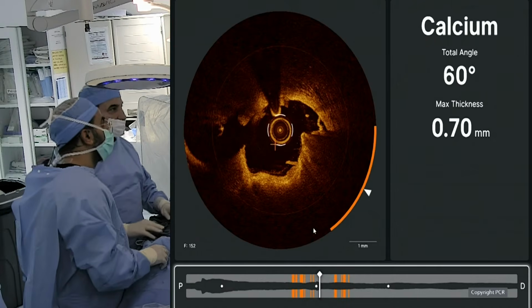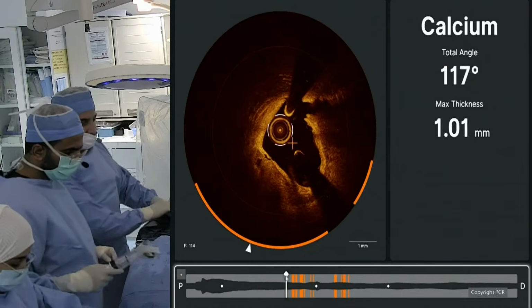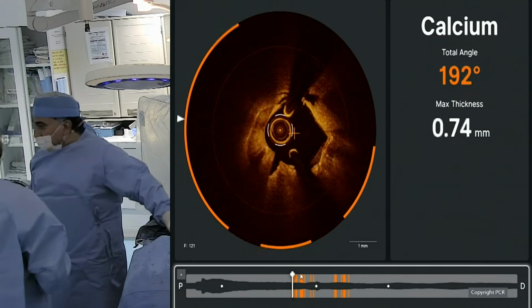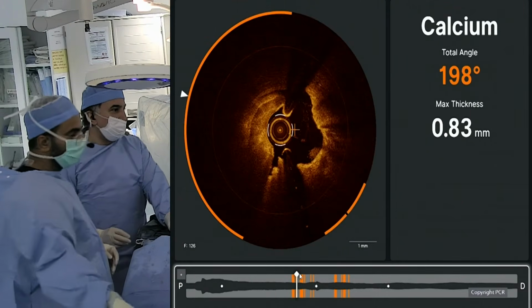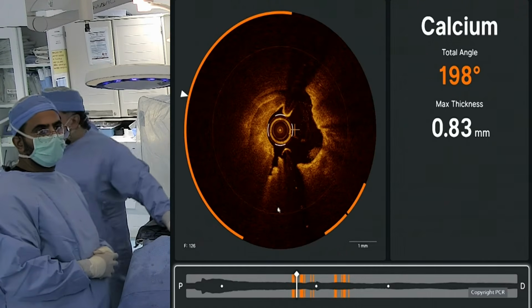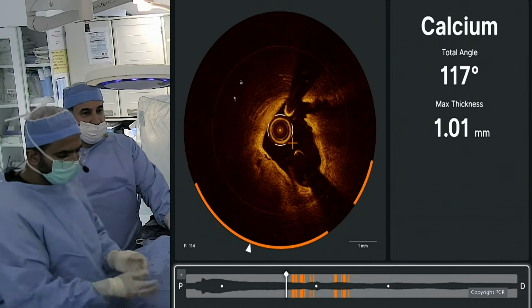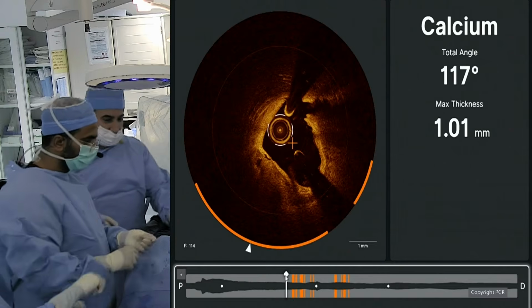And if you can go proximally. Give me a 2x30 balloon, regular. You can see a lot of damage at all. And this is some plaque that we have before in the proximal part. Here you can see that the calcium is almost encircling the vessel. But it's cracked. Before the yellow, before the orange, there is still some significant plaque. We needed to understand where to land. Can you see that there is still clearly calcification, identified by the orange line?